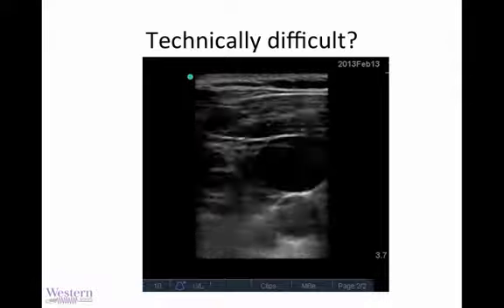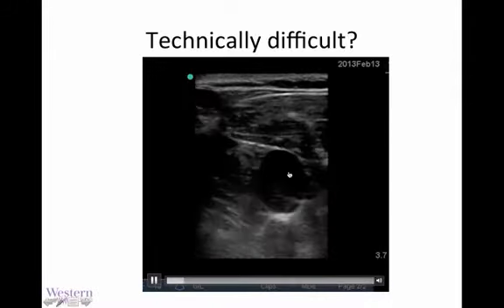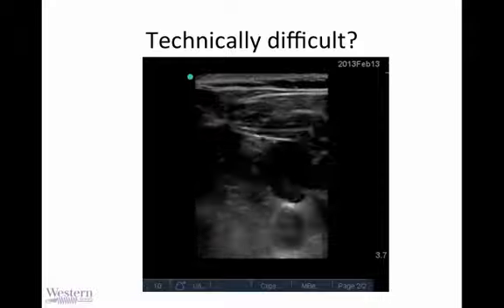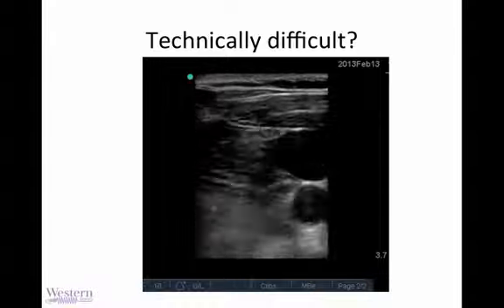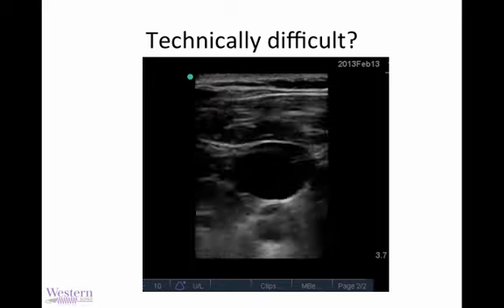And perhaps the ultimate technical difficulty or complexity is this patient receiving CPR with their IJ lying directly over top of their carotid. This is an immediate invitation to perhaps choose another site or to lower your expectations in the context of cardiac arrest. I would favor choosing another site, either a femoral approach for good reason or a subclavian approach.